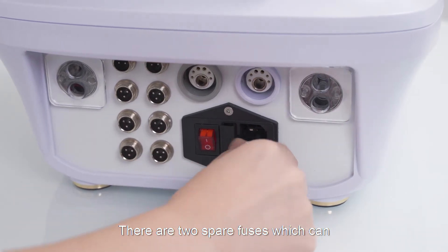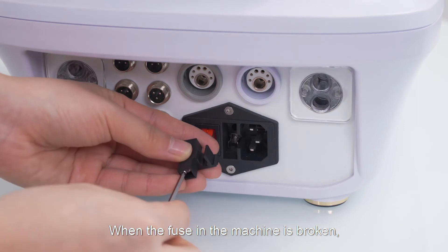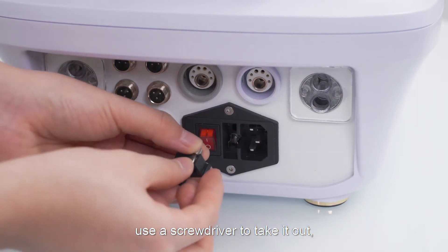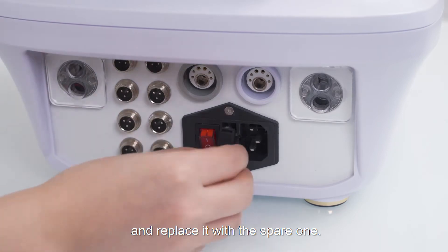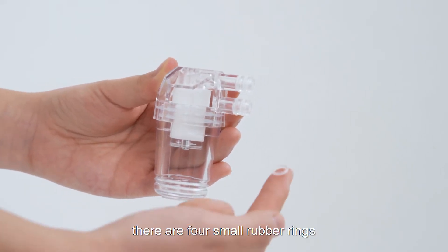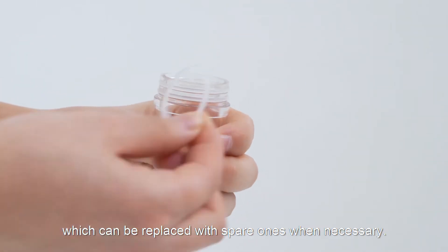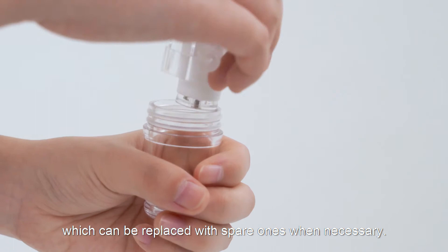There are two spare fuses which can replace the broken one in the machine. When the fuse in the machine is broken, use the screwdriver to take it out and replace it with the spare one. In the store felt, there are four small rubber rings and two large rubber rings on the felt, which can be replaced with spare ones when necessary.